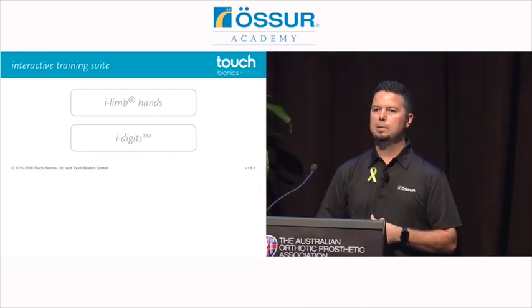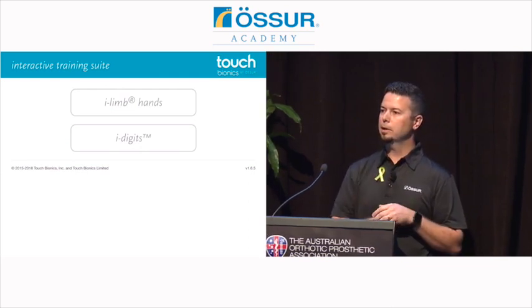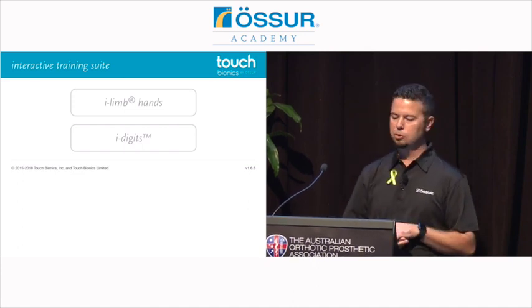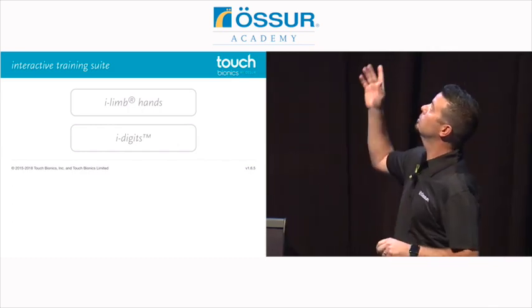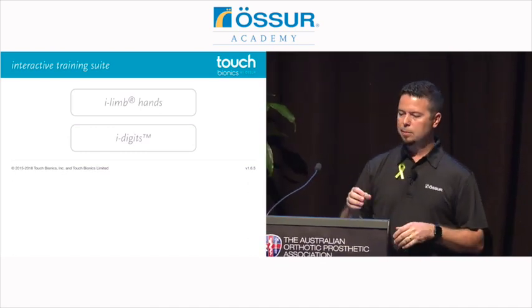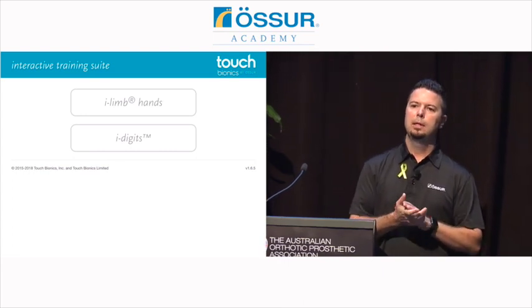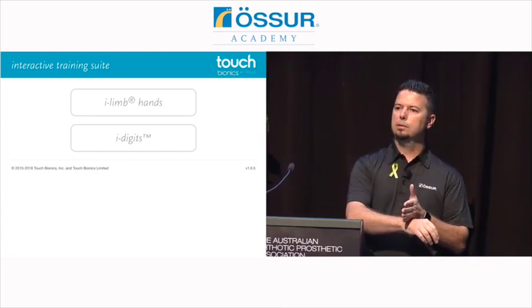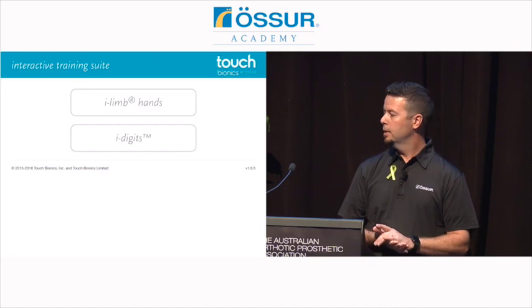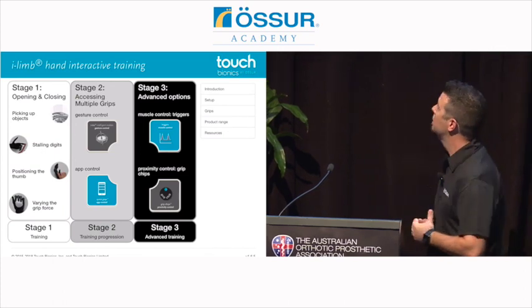So this training website, if you don't have those handouts, is www.touchbionics.com/training. When you type in that website, what you're going to be greeted with is what you're seeing on the screen here. We break up the training suite into iLimb hands and iDigits. iLimb hands are our full hand product for amputee levels through the wrist or more proximal, and iDigits is a partial hand solution. We'll talk more about each one of those. But to kick things off, we're going to start with the iLimb hand, so I'm going to go ahead and click on that iLimb hand icon.